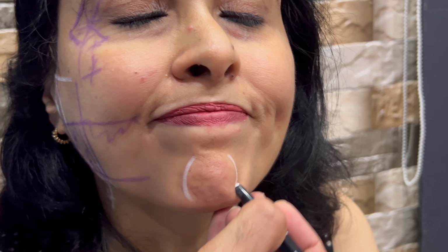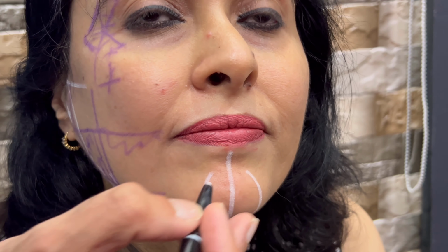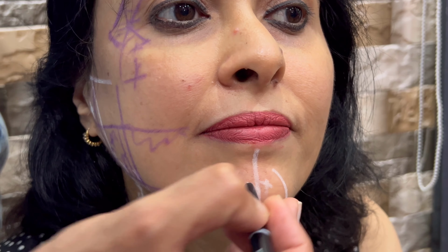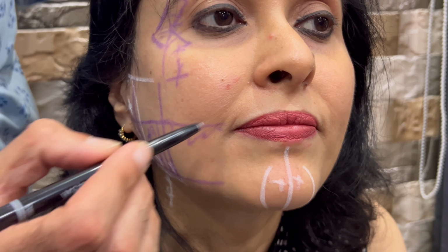Again, she's got a hyperactive mentalis. See this, how the mentalis is strong. So you mark the posterolateral extents of the mentalis. Relax. Then you mark the midline. Okay. And then 2 units and 2 units on either side of the midline for the mentalis. Okay. The DAO.